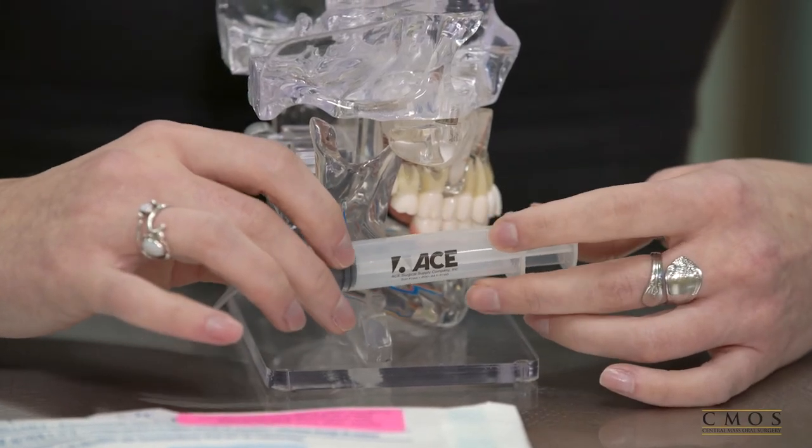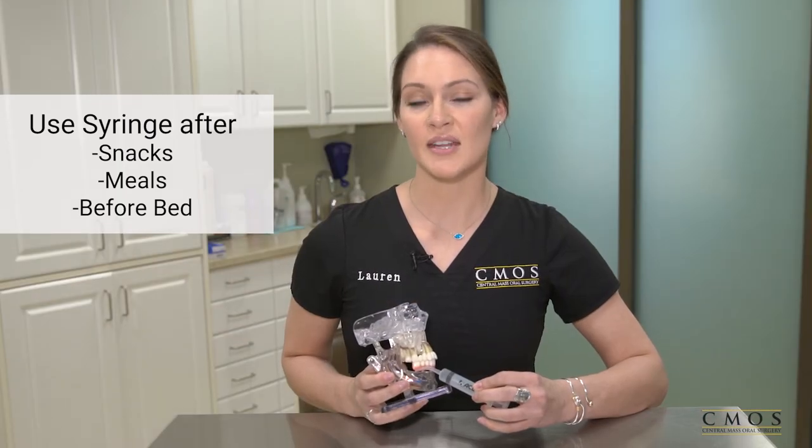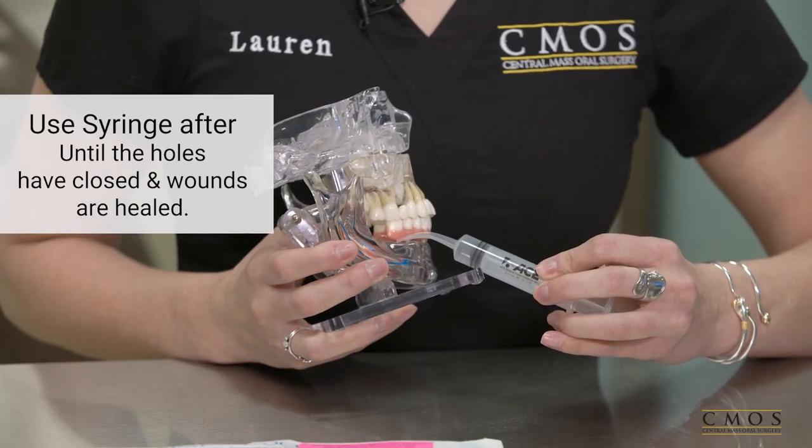You should use the syringe after snacks, meals, and before bed until the holes have closed and the surgical wounds are healed. If you have any questions regarding the use of the syringe, the duration, or the placement, please feel free to give us a call — we're here to help you.